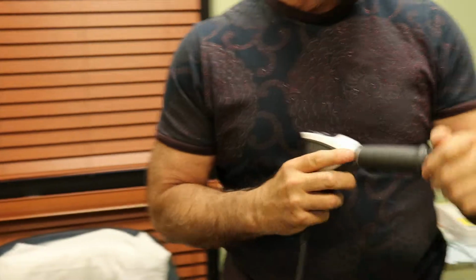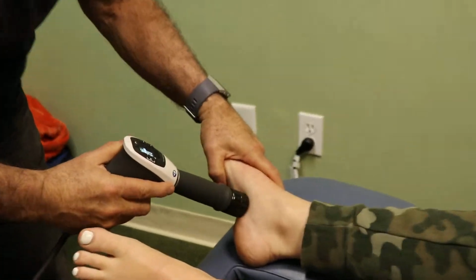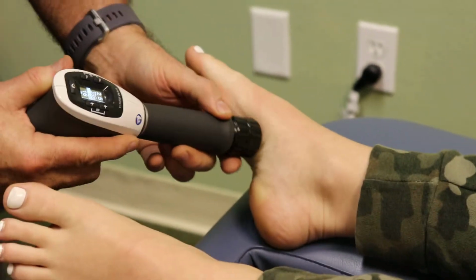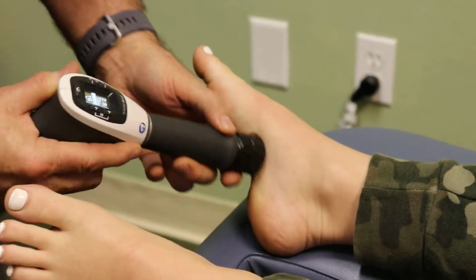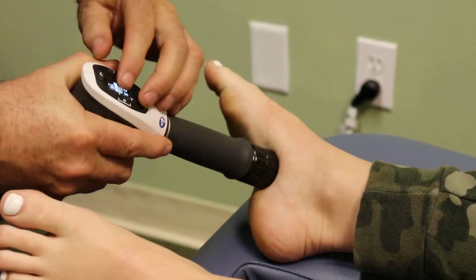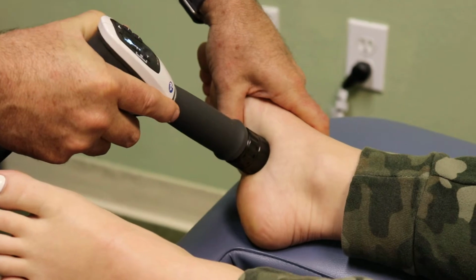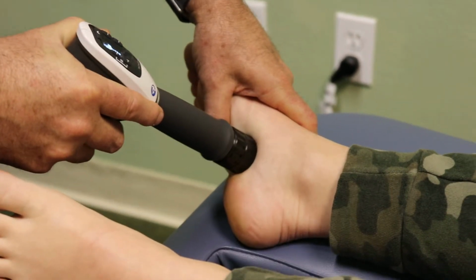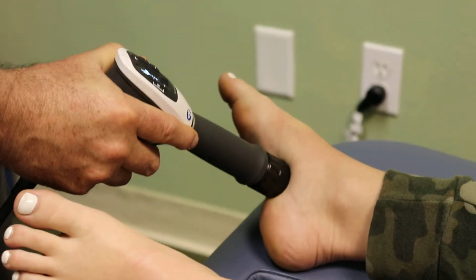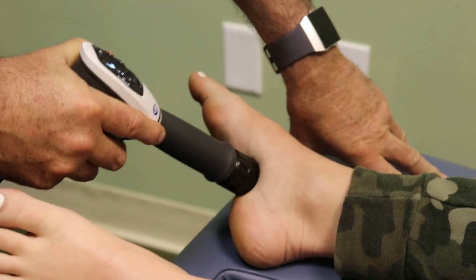And again, if we then demonstrate on a patient of mine, Brianna, she has plantar fasciitis. So if I wanted to work the plantar fascia, in this area is ligamentous tissue, we could use the ceramic end, but we'll just use this. I can just work right into the trigger point, which again will sound like this. And again, not too painful, right? No. And I can leave it there. The total treatment time is in the device here, 2,000 impulses, which basically takes about 2 minutes.